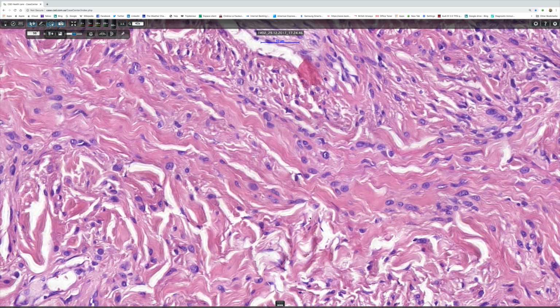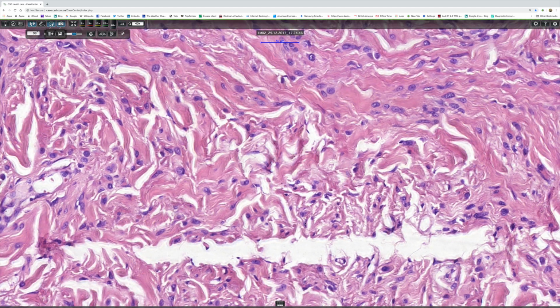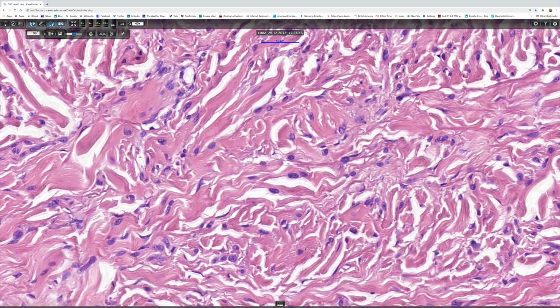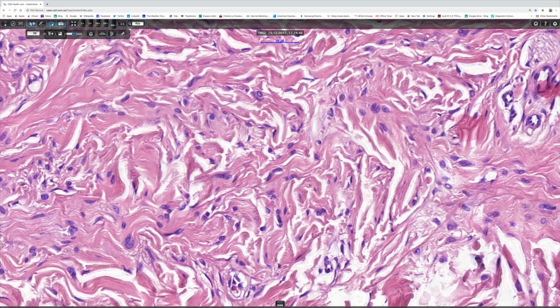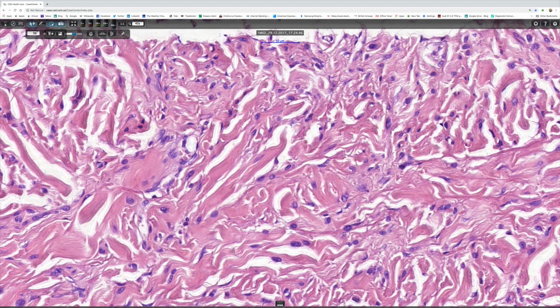Well, this is the bit of the lesion that we need to be looking at really, because this is telling us this is the desmoplastic part. And it's composed of smallish cells. They're epithelioid, they have round or oval nuclei with small nucleoli, and they certainly get smaller the deeper you go. So I think this is showing good maturation. There's no perineural infiltration.